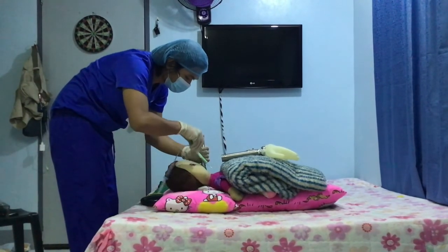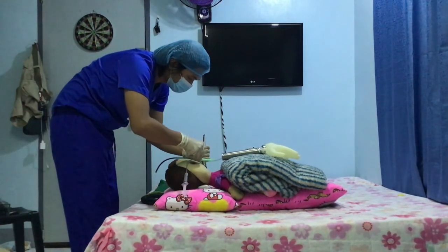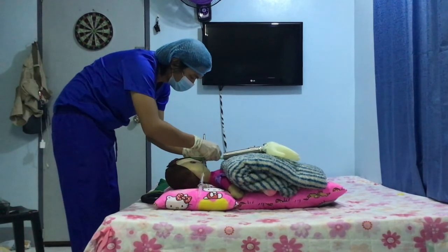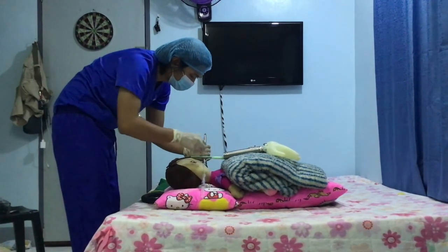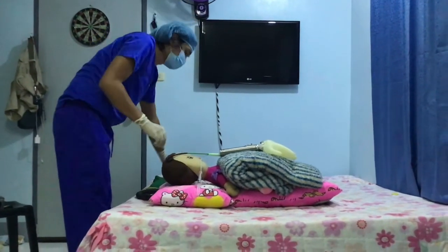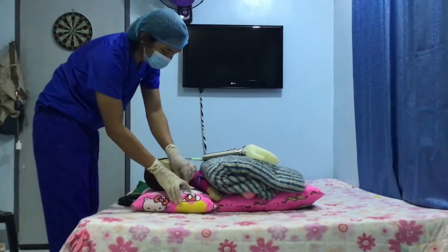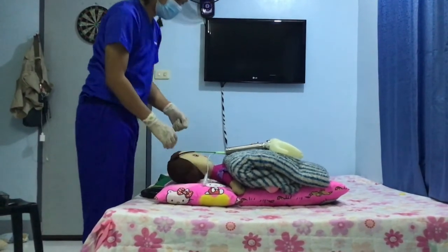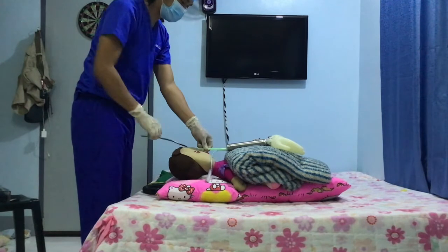The bevel must face left to facilitate better view of the vocal cords. Advance the tube until the cuff is 3 to 4 centimeters below the vocal cords. Then, remove the laryngoscope. Inflate the cuff with 10 ml of air using the syringe to create a seal in the tracheal wall. Remove the stylet.